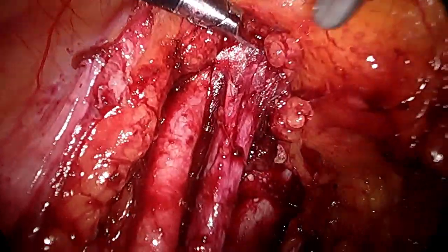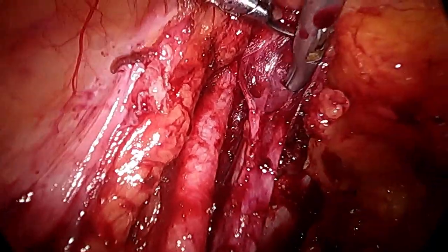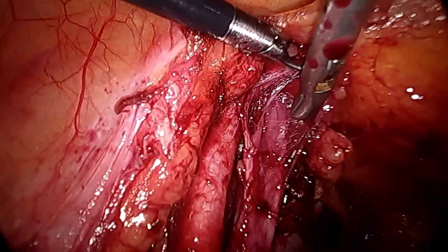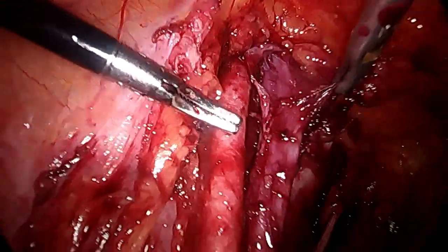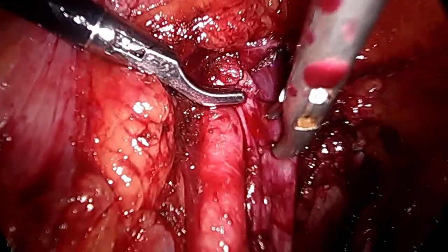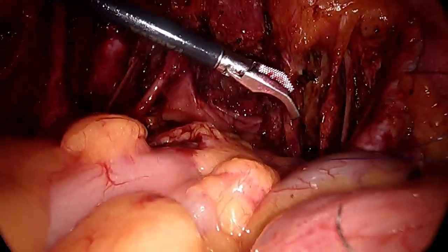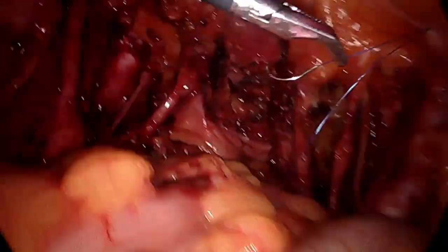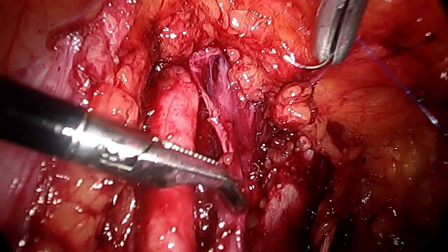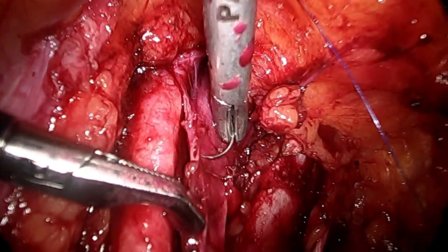Fortunately, this injury was at the 12 o'clock position of the wall of the external iliac vein, and hence the bleeding was minimal as the pressure in the vein is hardly 2 mmHg. There is an argument that doing laparoscopy in venous injury can be dangerous considering air embolism, but we have done quite a few such cases where we accidentally injured the vein. In a few cases we achieved hemostasis just by compression, and in this case we did suturing, but in none of the cases did we encounter any complication of air embolism, and the literature also supports this finding.